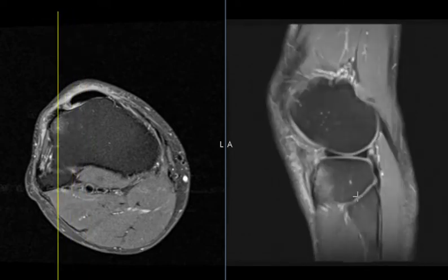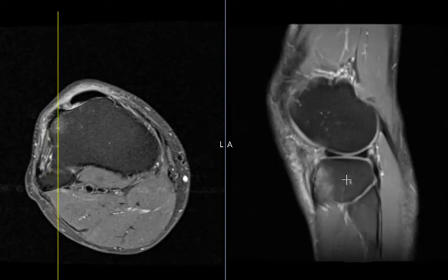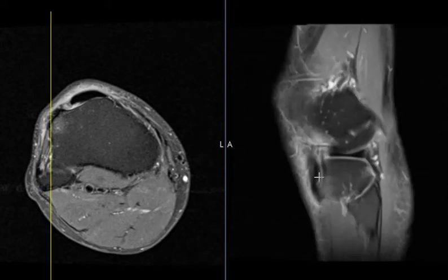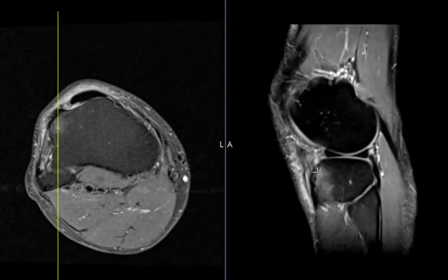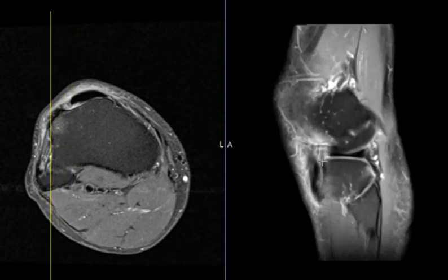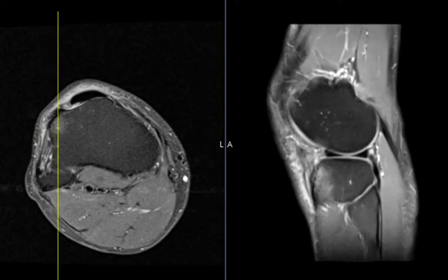And there it is — as we start to get into this foggy area over here. On this view we see the iliotibial band coming down and attaching on this bony protuberance. And we see this bright signal of the marrow edema. This is a chronically inflamed iliotibial band that's thick and it's tugging away and irritating this bone where it attaches.